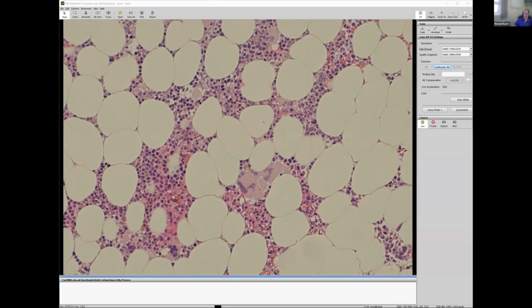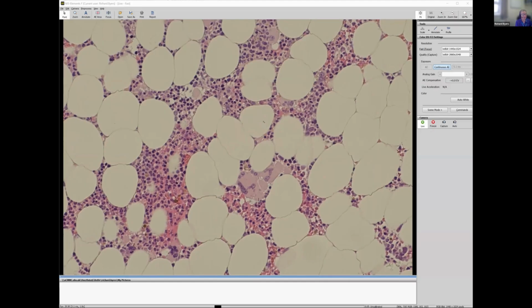So it can be difficult assessing these because after treatment, you can quite often get atypia in the megakaryocytic lineage, either architectural or cytological or both, due to response to rapid regrowth. But even so, you shouldn't get large clusters like this.